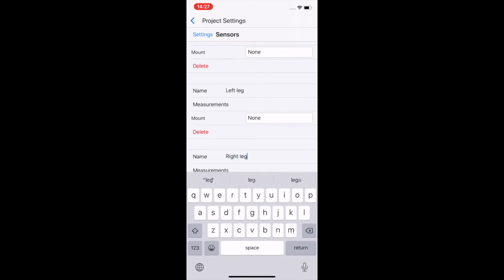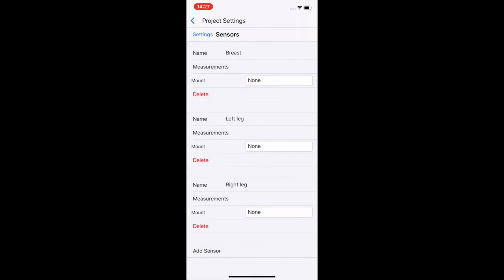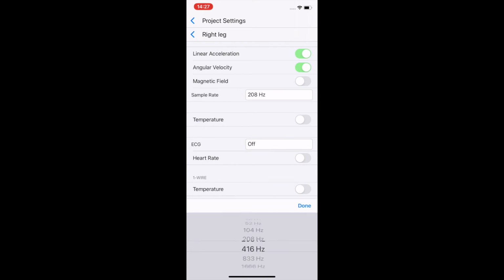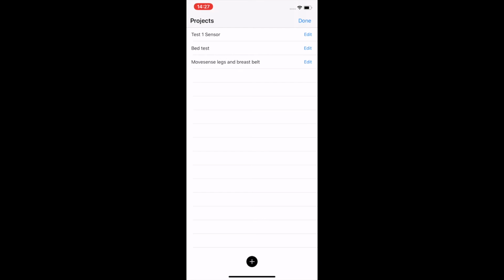Once we have done that, we do the same thing with the right leg. We take ECG data off and go on. But since we're using the new Movesense 2.0 version, or the upcoming 2.0 version, we actually go to 416 Hz with linear acceleration and angular velocity, which is pretty nice. And this is only possible with Bluetooth 5, so that we get enough throughput to the device.